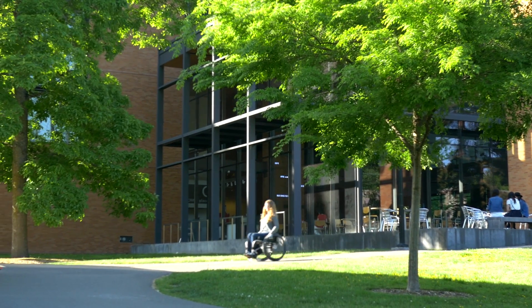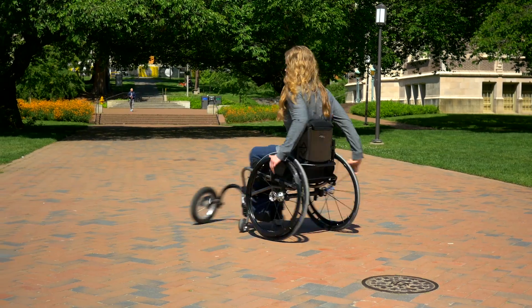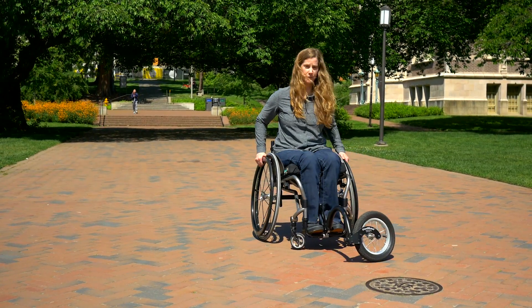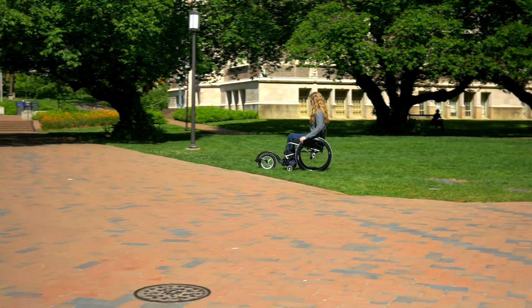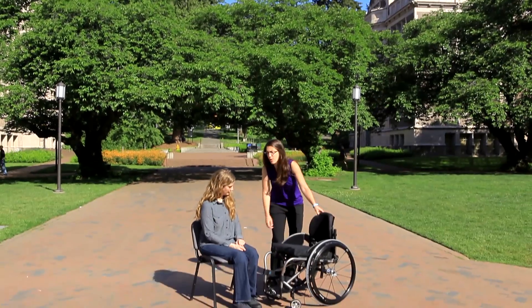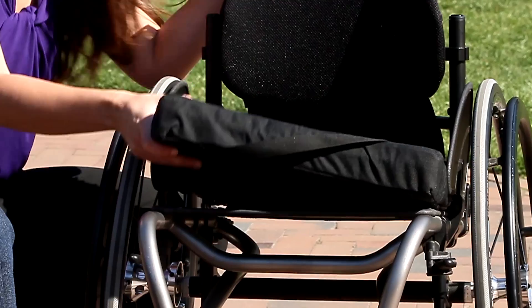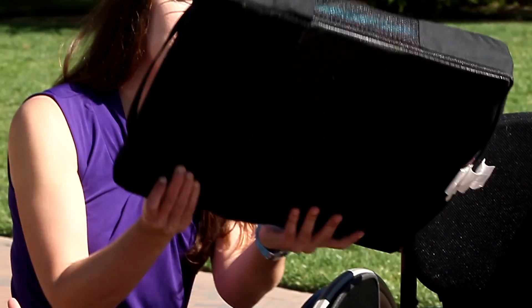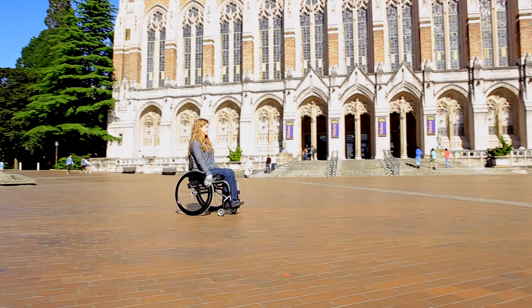If you struggle to maintain good wheelchair pushing form, you may need to think about other wheelchair products on the market. You may want to explore a mechanical or motorized attachment for your ultralight wheelchair, or potentially a power chair. A wheelchair seating clinic can help you make these decisions over your lifetime. Continually reevaluating your wheelchair seating and technique will help you preserve your shoulders, avoid pain and weakness, and be as independent as possible as time goes on.